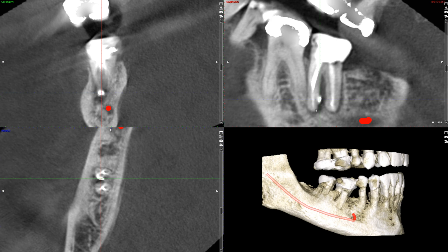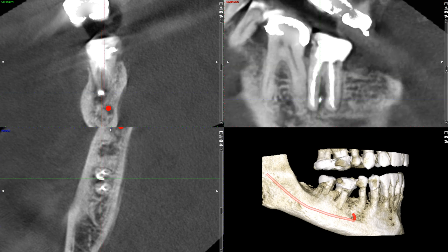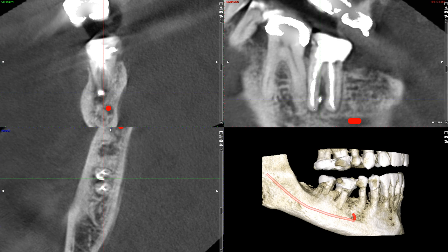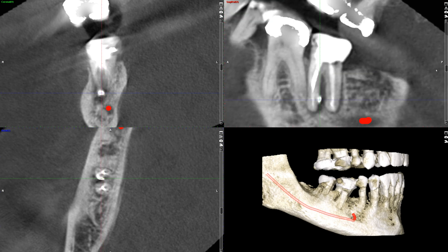Another possibility is that there may be a lateral canal or an accessory canal that we are not really seeing, and that canal is unfilled — hence we could have lateral radicular periodontitis. Another possibility is root fracture involving the mesial root, given the very classic J-shaped bone loss pattern.